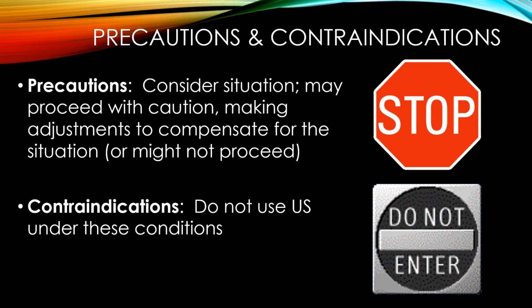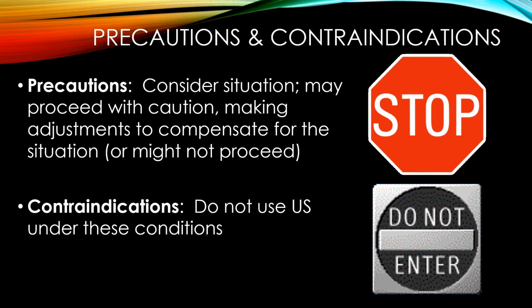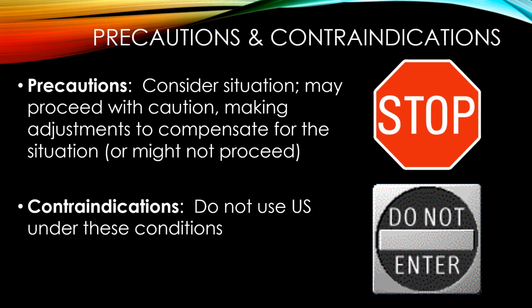Precautions are kind of like a stop sign. If you approach a stop sign, you are going to come to a complete stop, look both directions, and decide whether it is safe to proceed. If you do choose to proceed, you might make some adjustments or be careful as you do so depending on the situation. Similarly, if you are doing ultrasound on a person and they have a precaution, you will consider the situation. You might decide to proceed with caution, and you might make adjustments to compensate for the situation. On the other hand, you might decide not to do ultrasound at all.